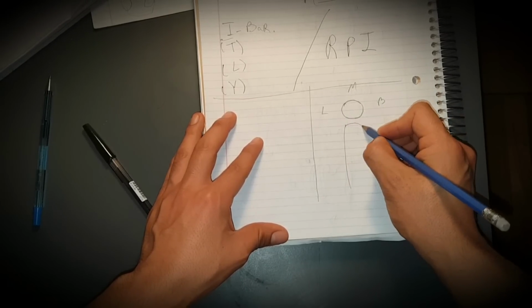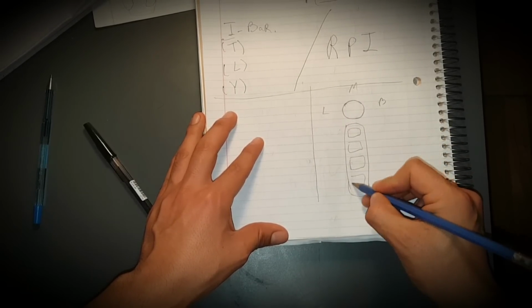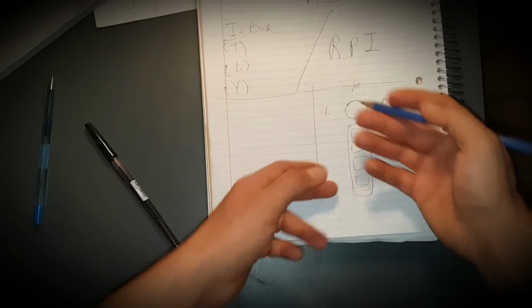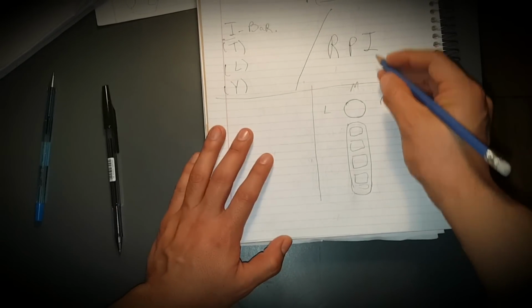I always do my open lattice work, just like that. It doesn't matter here, it's not the number of teeth. I just put whatever, like 2, 3. It doesn't matter.